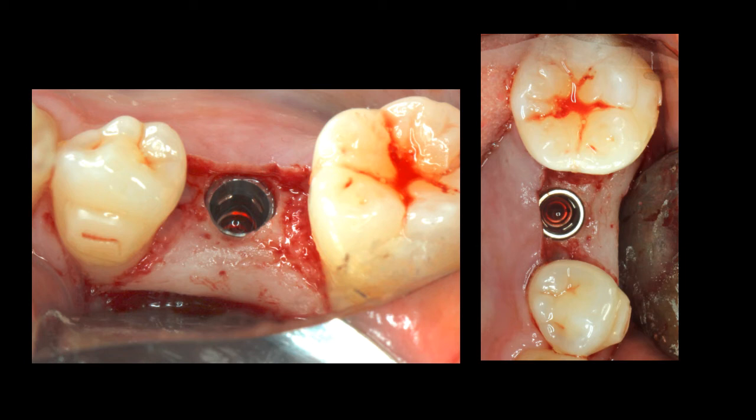On the right hand side picture, we can appreciate adequate bone dimension between the implant and the buccal plate. We need at least 2 millimeters. Well, if you want to push it, it can be 1.5 millimeters all around the implant for good long-term implant and bone viability.